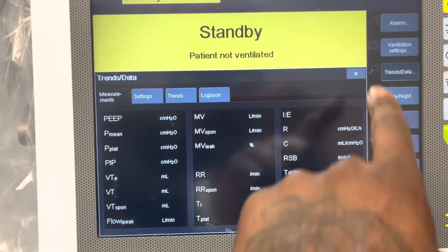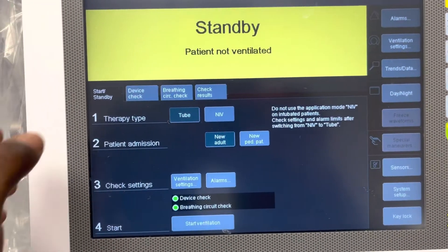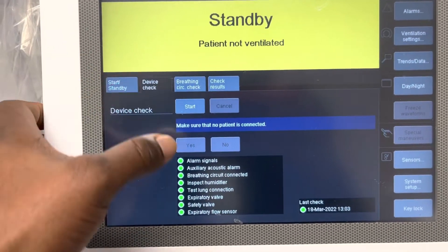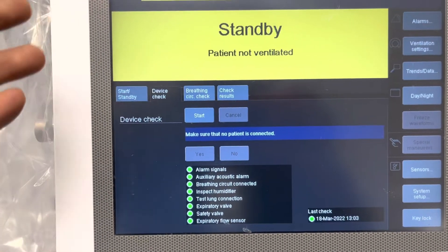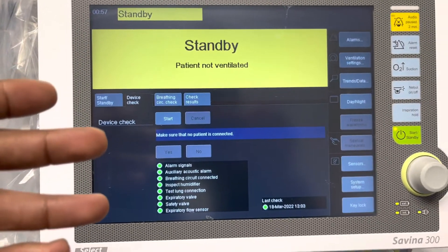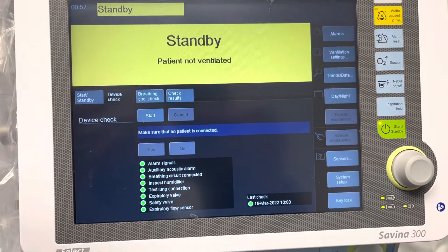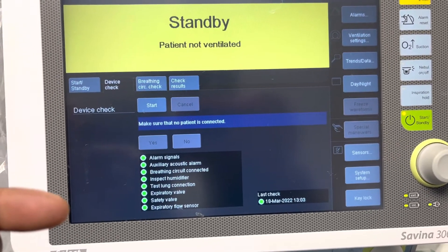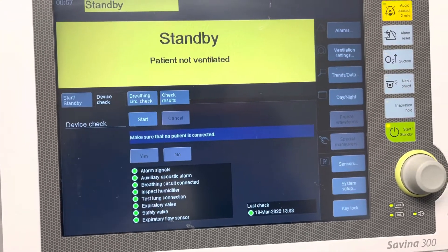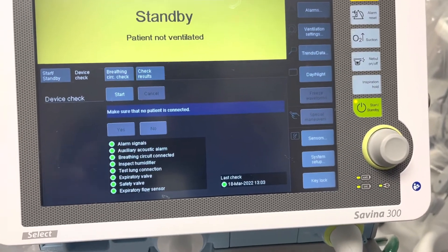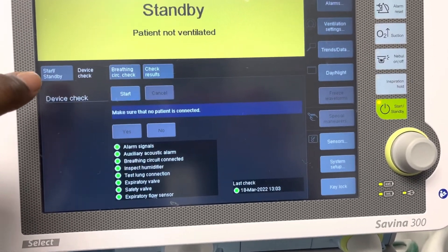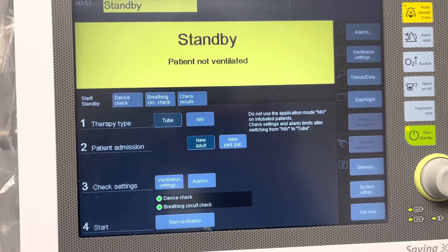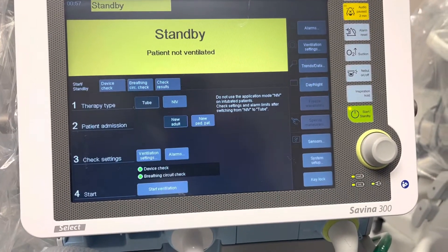This is a quick overview of the Savina 300. Regarding the system check — when we are cleaning the ventilator and setting it up for a new patient, we want to run a device check to make sure the device is working properly for the next patient. We are currently in standby mode because we have no patient to put on this machine.